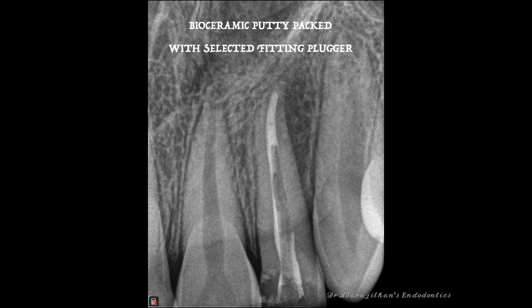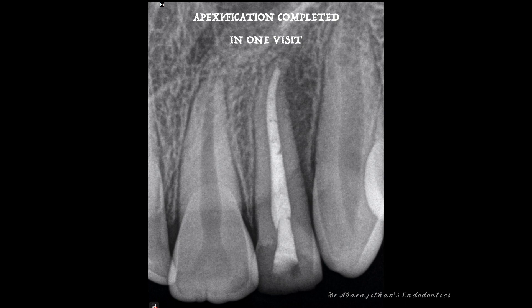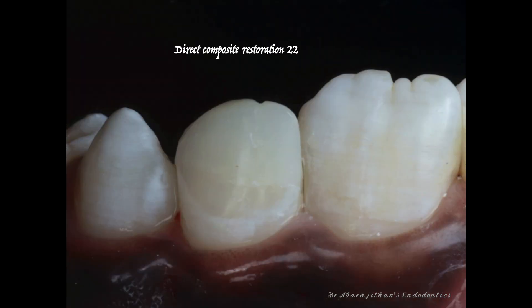I carry the bioceramic putty with my plugger, place it into the pulp chamber, and slowly start condensing with my pre-fit plugger. We know it cannot be pushed beyond the apex because the plugger fits well there. The apical barrier formed with the bioceramic putty is visible in less than 20 to 30 seconds effortlessly. I confirm it with a radiograph, wait about 10 minutes for the initial set, and then do the backfill using the GuttaSmart from Dentsply along with a bioceramic sealer — Ceraseal — completing this apexification in just one visit. We also did internal bleaching considering the patient's age.